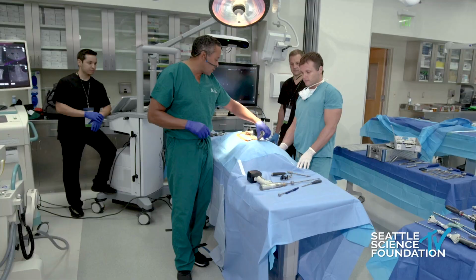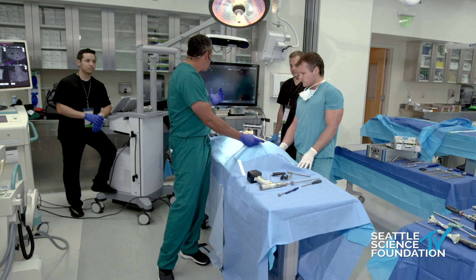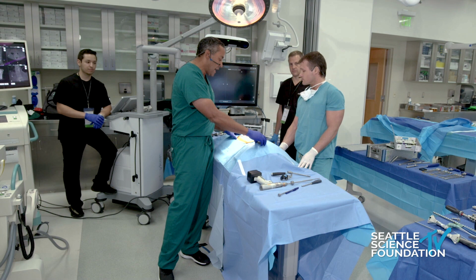And then we're using the Stryker navigation system. This is their new Q system, which actually just came out within the last few months. I actually have not used this in a human being yet. I've only used it in the lab. There's a couple of ways of doing this.